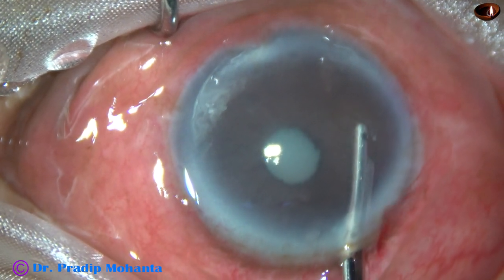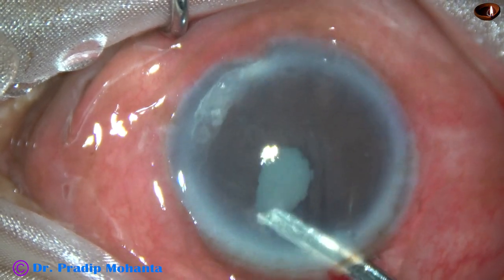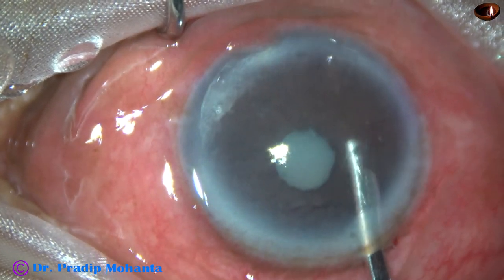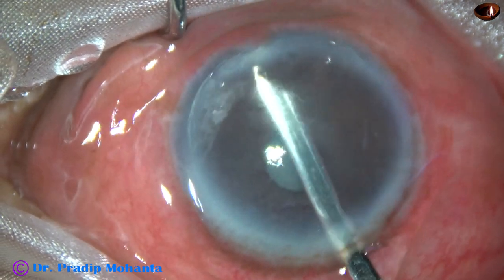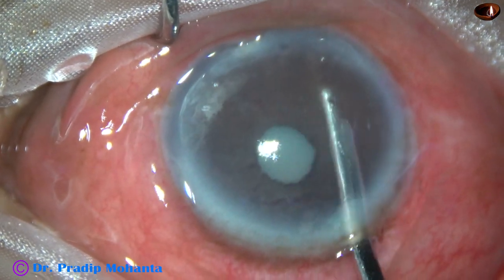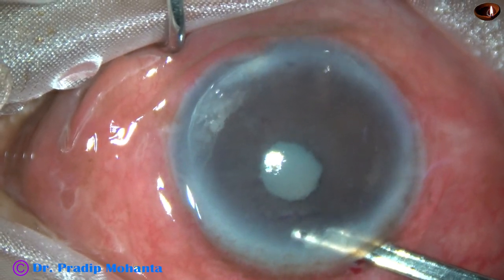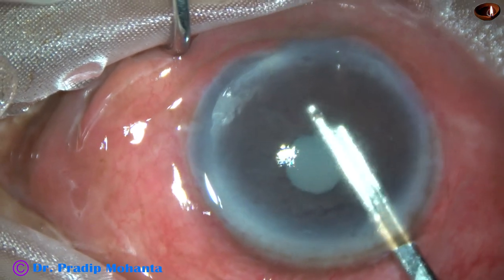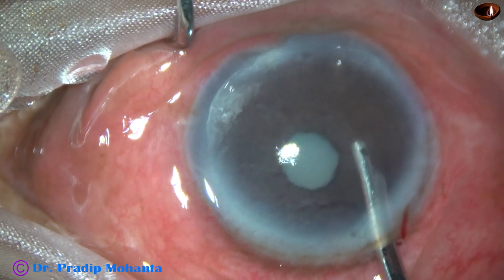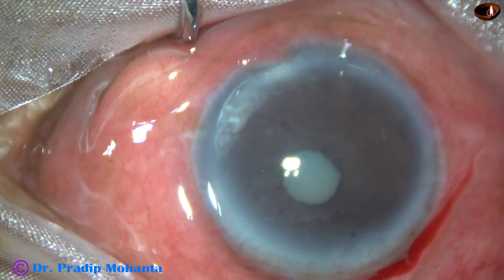The pupil is very small. We instilled pupil-dilating drops, but there is no effect. My plan is to use a pupil expansion device in this case, but the pupil is so small that I need to stretch it a bit first. I could also use iris hooks, and probably that would have been better in this case.